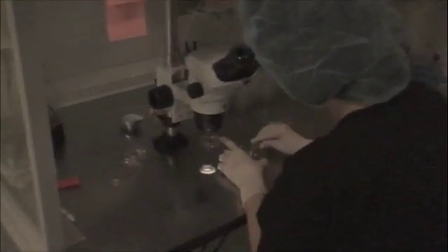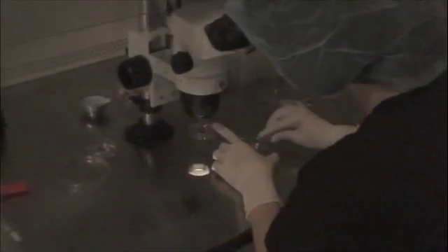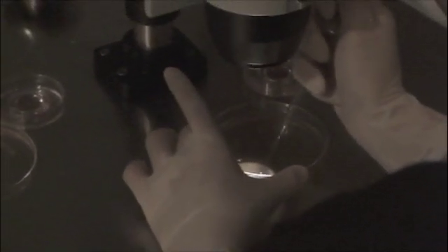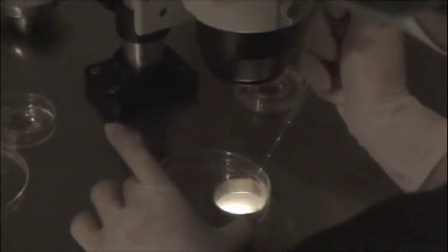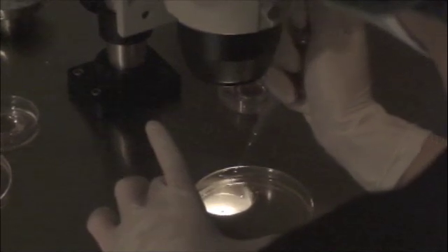The test tubes are placed temporarily into a warming block to prevent the temperature from dropping. The embryologist will then take the individual test tubes and pour the fluid into a sterile dish. The fluid in this dish will then be examined under a microscope, and the individual eggs will be collected and saved for fertilization later on in the day.